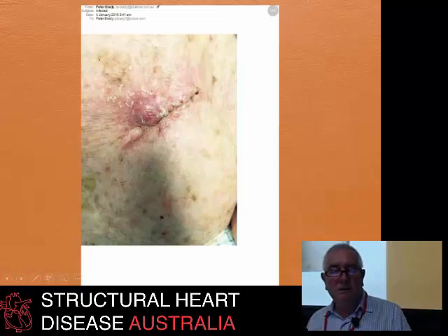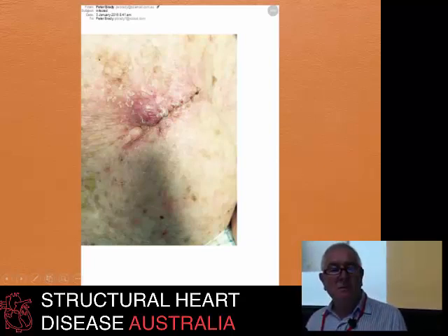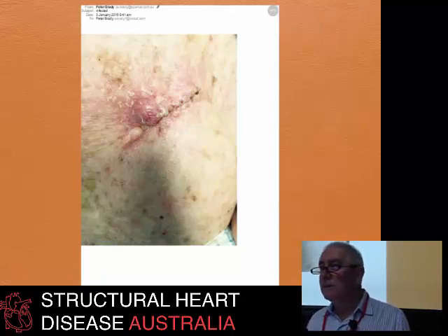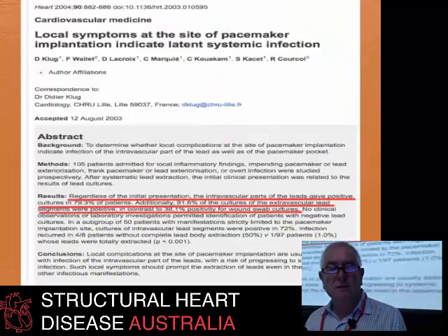What do we do about this? This is a patient that came to see me, a device implanted somewhere else several years earlier, this doesn't happen to us, and this is what it looks like. Many people would be tempted to just treat this with antibiotics. I think as we're getting smarter and we've got more evidence, we know that's not the right thing to do.